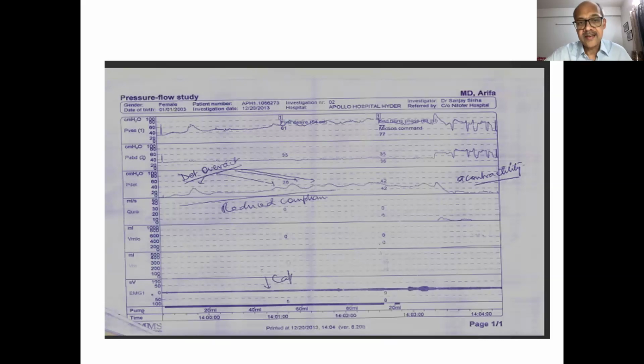Put the patient on CIC. Now, if the patient has come on a catheter, then these pressures can be spuriously high because of catheterization. If the patient has had 6 months of catheter, then you do the test, you can get all these storage abnormalities as an artifact just because of a long-term catheter. So you have to interpret it in the right context. So I'd put in an indwelling catheter, see whether the kidneys improve, start antimuscarinics, and put this patient on CIC.